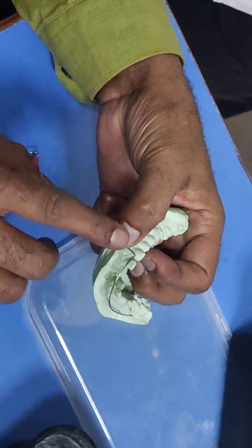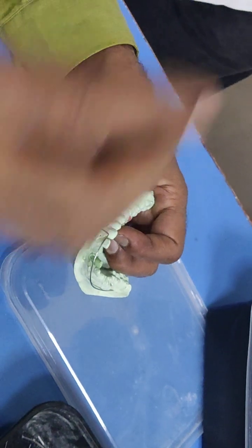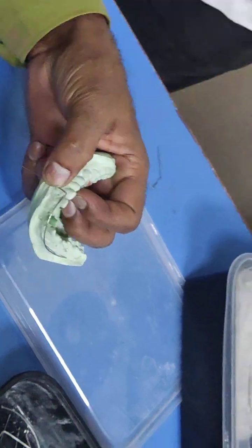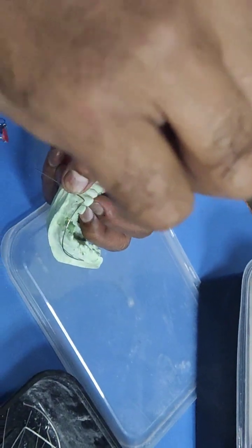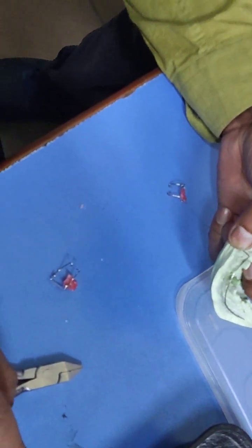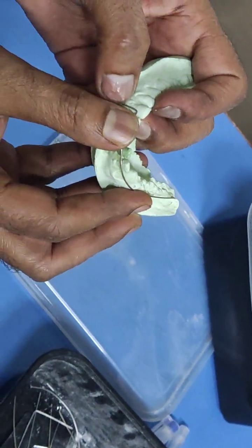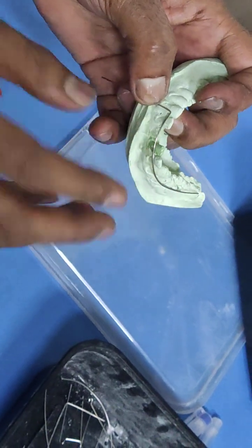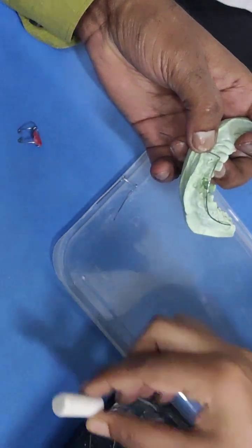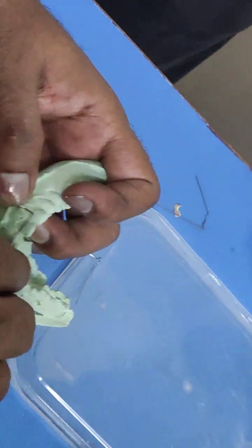Remember, the topmost part or the apex of the U-loop will not go beyond 3 mm from the gingival margin of the canine or premolar, that is, the gingival zenith. Here I am holding it almost in the middle. That means you can mark it here. The apex of the U-loop will not go beyond this region. Not more than 3 millimeter, maximum. This is the maximum permissible limit.